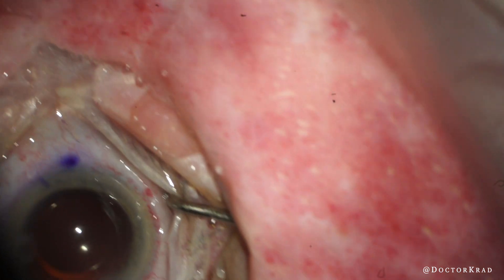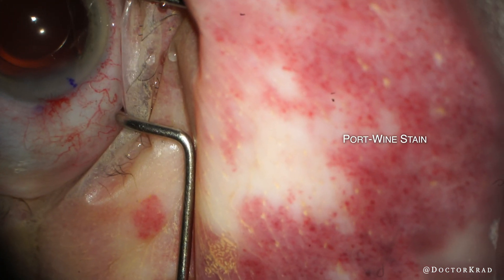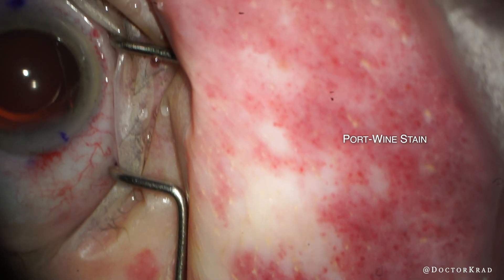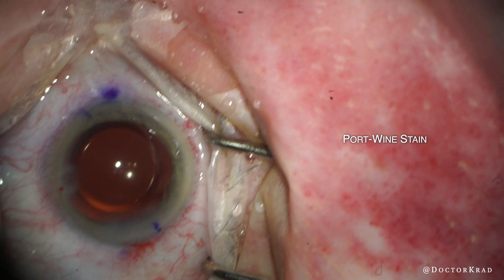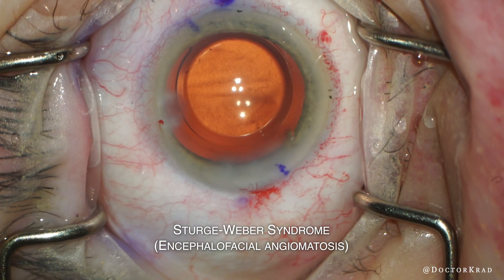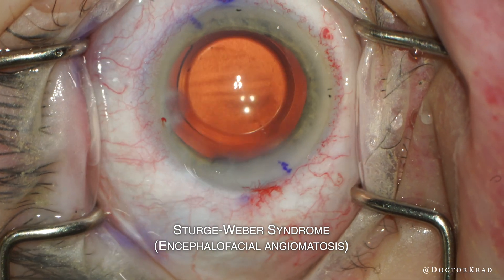You can see this all the way to the eyelid margin. The abnormal blood vessels are apparent not only on the skin but on the surface of the eye as well as inside the eye. The abnormal blood vessels can also be found in the brain. This is a feature of Sturge-Weber syndrome, or encephalofacial angiomatosis.